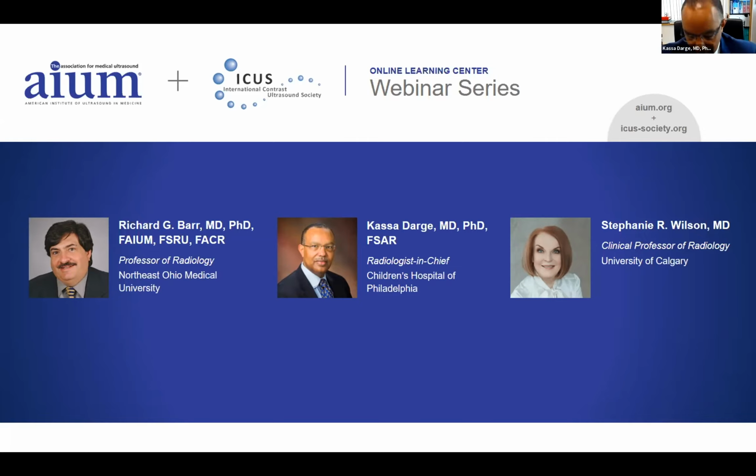Thanks, Kassa. So I work in a large tertiary institution and have a small ultrasound department that's focused on CEUS. And I quickly realized that to expand a practice in that kind of hospital environment, it required more than just me to be able to do contrast ultrasound.